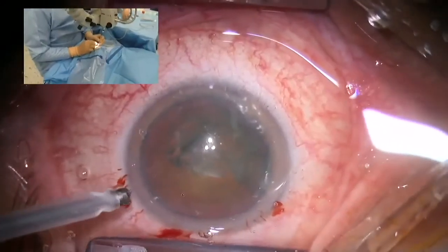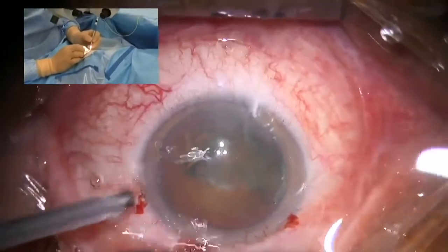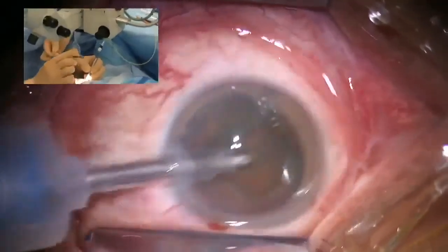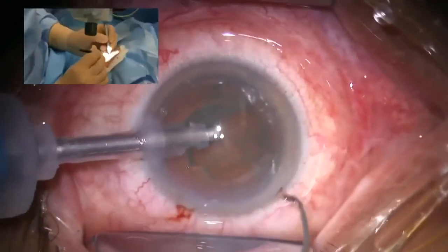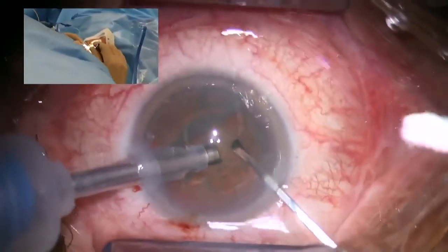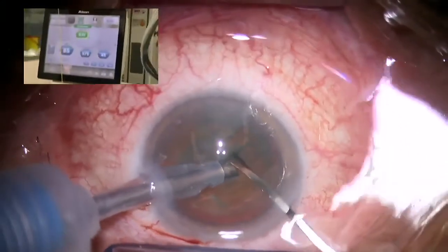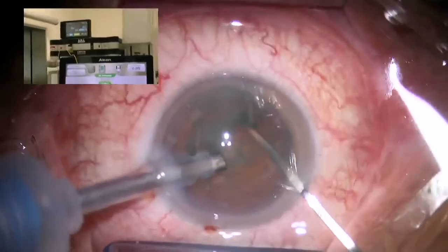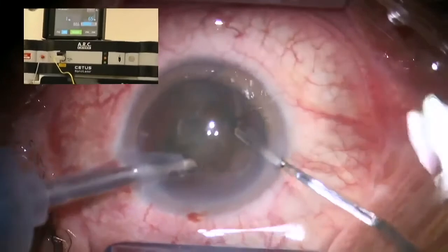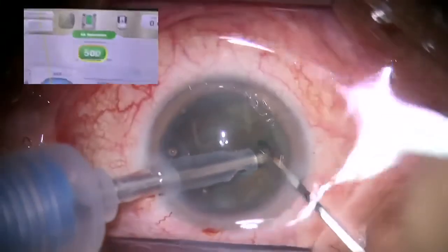There was a question about the surgical technique of the nanolaser, so I try to show you the chopping technique. The chopping technique of the nanolaser is different as it is in the phaco. I don't make a groove, I make a hole inside and then use it as a place to separate the lens. And then you can easily remove both halves or quarters of the lens.